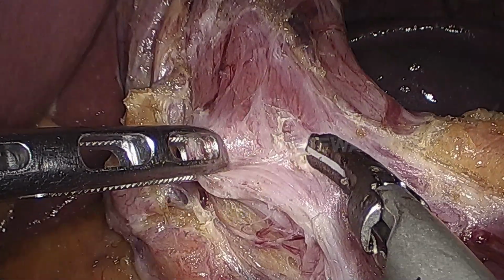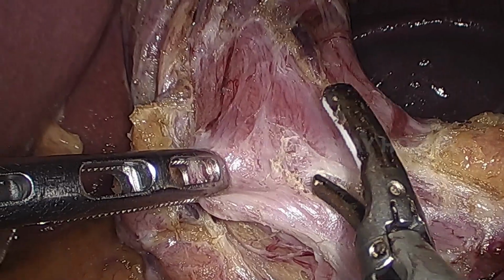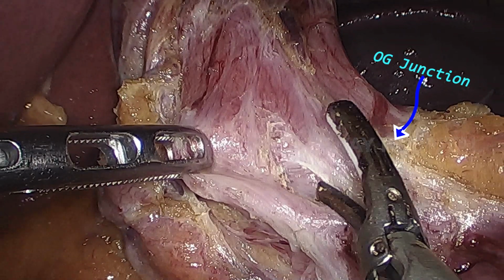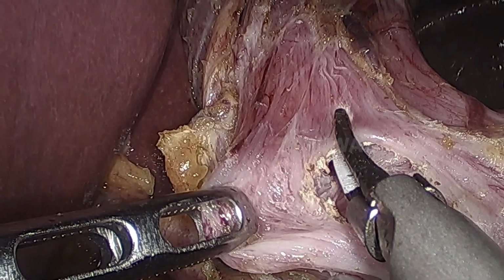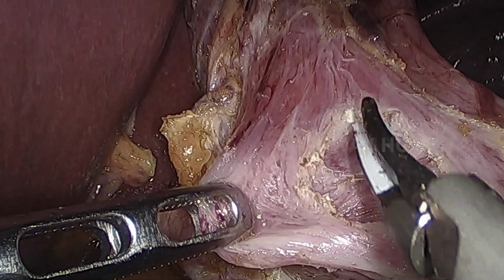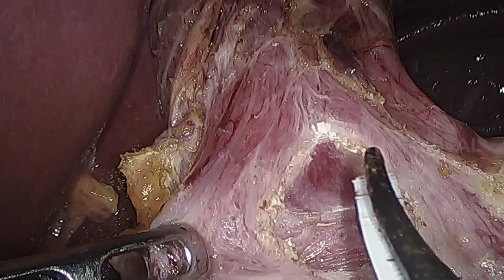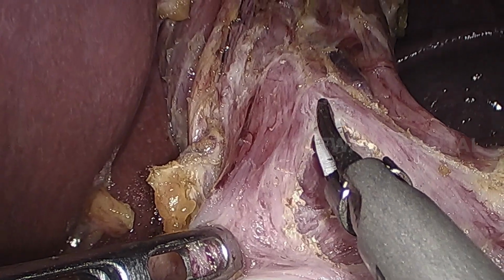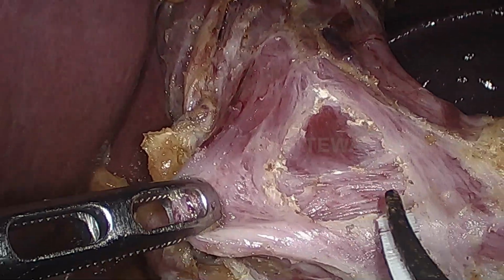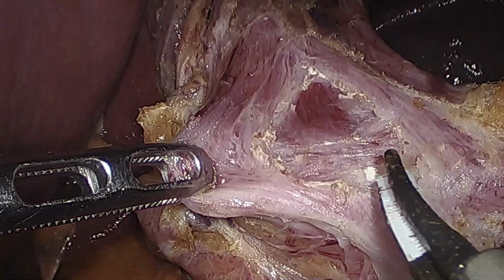We have started esophageal myotomy. The myotomy has to be started first on the esophageal side, because it is relatively easy to enter a plane between the mucosa and the circular muscle on the esophageal side, and after completion of the esophageal side myotomy, then only we will come to gastric side myotomy.